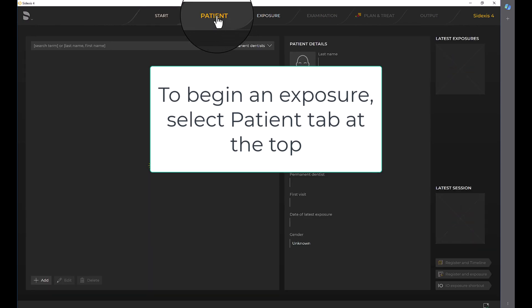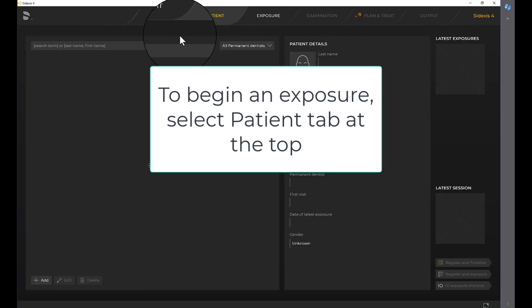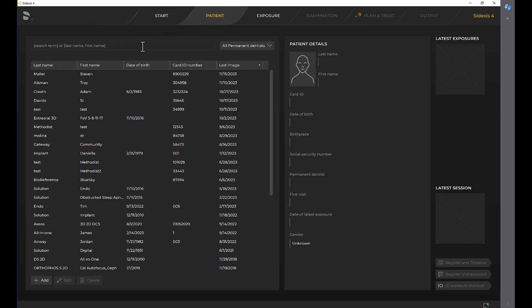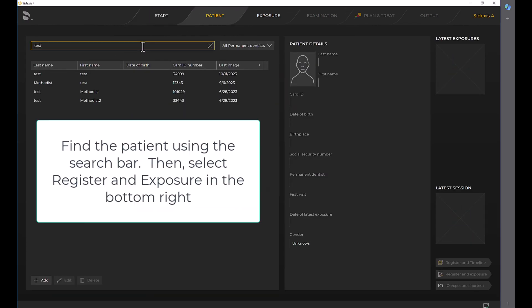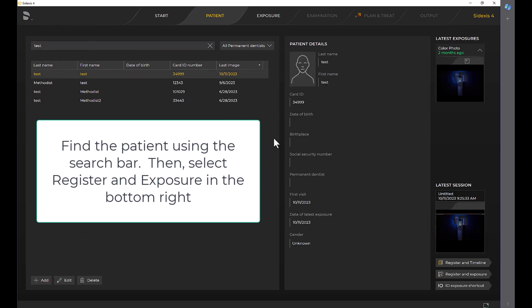To begin an exposure, select the Patient tab at the top. Find the patient using the search bar, then select Register an Exposure in the bottom right.